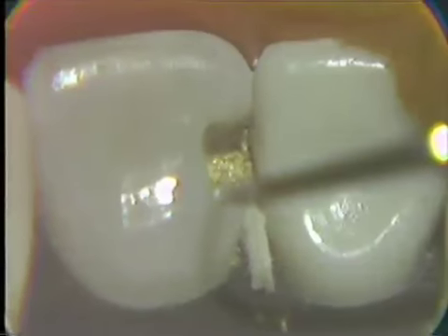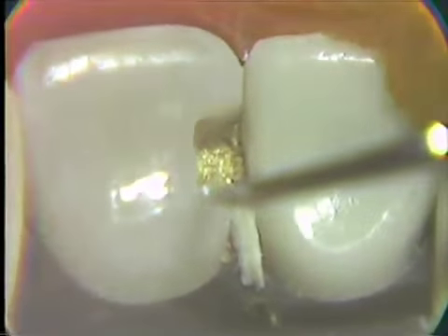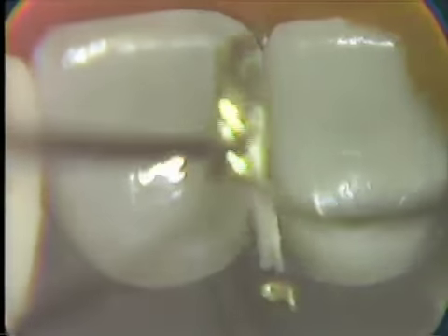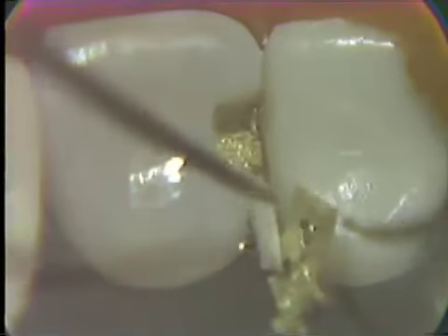We can then carry through with an additional piece of foil that will be carried on up the labial wall and be tucking this into the incisal area.